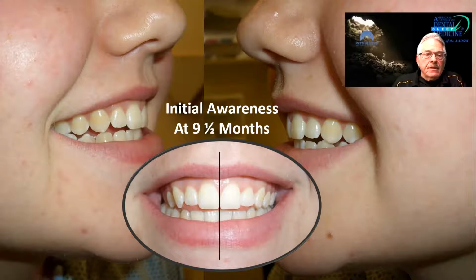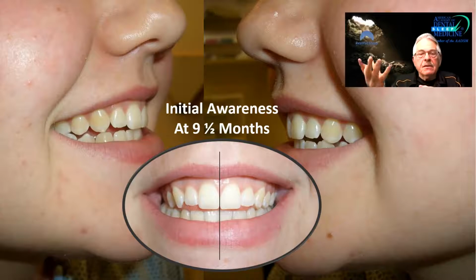So we take her out of the appliance, okay? And what we want to do is see, okay, we take you out of the appliance and we want to strike a balance. Do you have to go back on meds? So my arrangement with her was this. You go out of the appliance, you stay out of the appliance until you feel like you have discomfort that was of the status that made you get on meds to begin with. When that happens, you put the NTI appliance back in. And let's see if we can get some of this to return to, quote, what was your normal again.